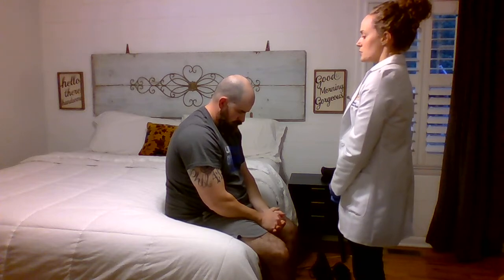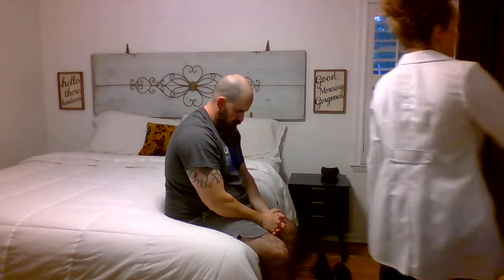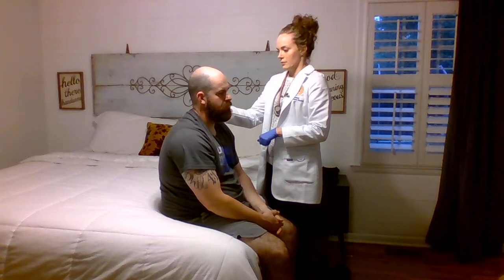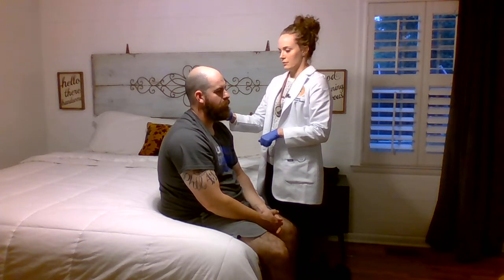All right, we're going to do another little hearing test here. It's going to check for sensorineural or conduction hearing loss. So what I want you to do is I'm going to place this on this bone right here behind your ear and then also in front of your ear. You need to tell me when you stop hearing the sound and where you hear it best at, okay? Can't hear anything. I hear that. And then when it goes away.